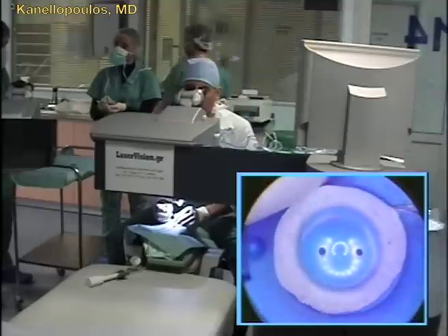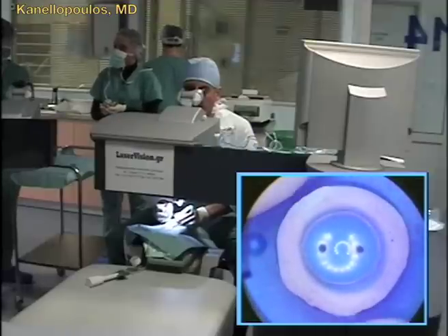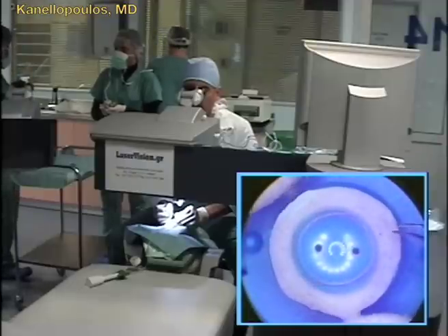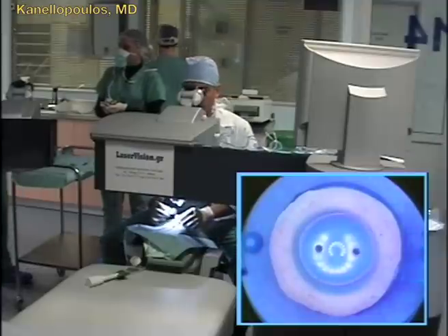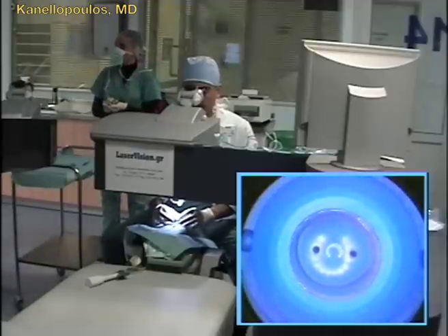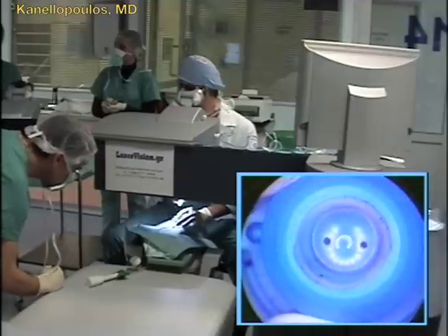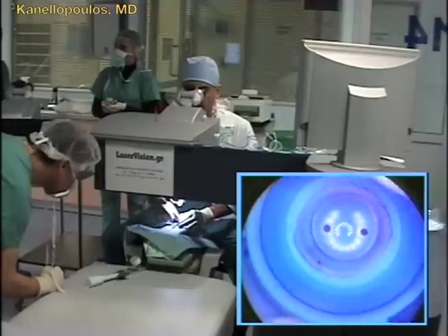We will place the donor, and you can see there's a nice scleral rim around the donor in order to secure the rim of the artificial anterior chamber and be able to reproduce the physiology of the anterior chamber so our femtosecond laser can trefine this cornea from outside to inside. This is very important in order to have the lips of the host and the graft interface match.